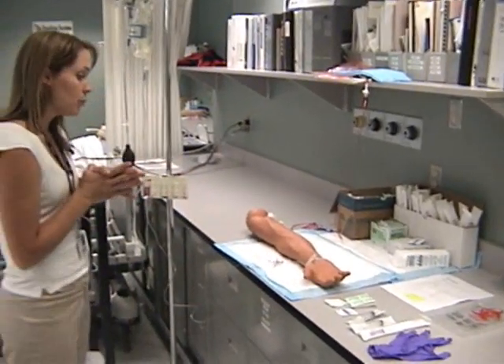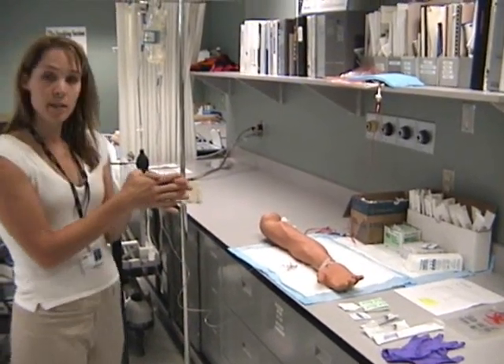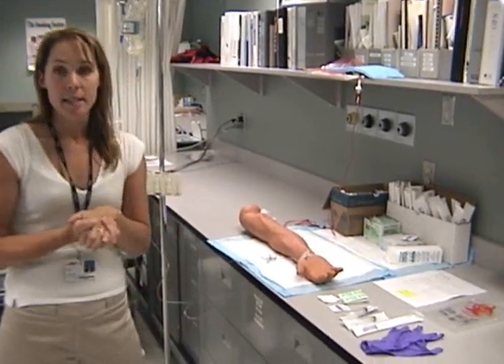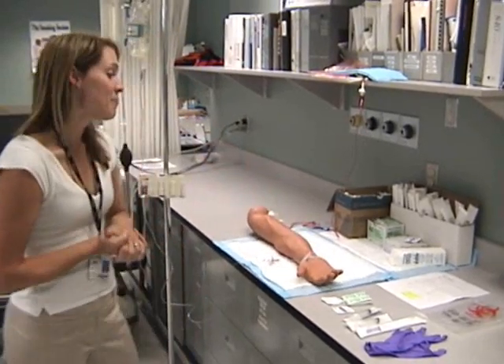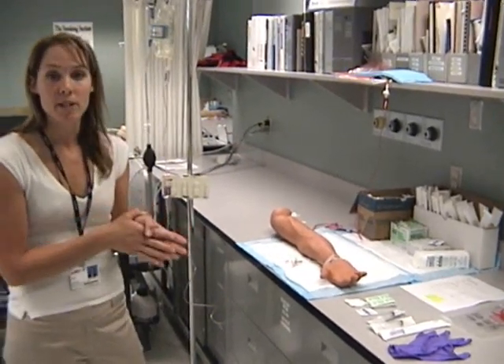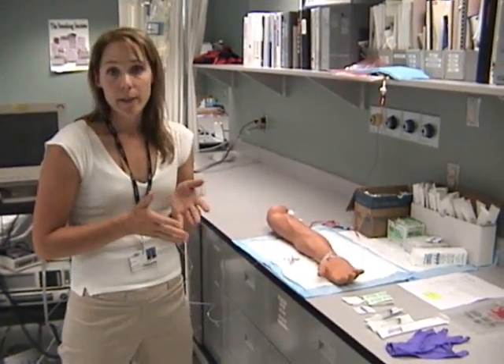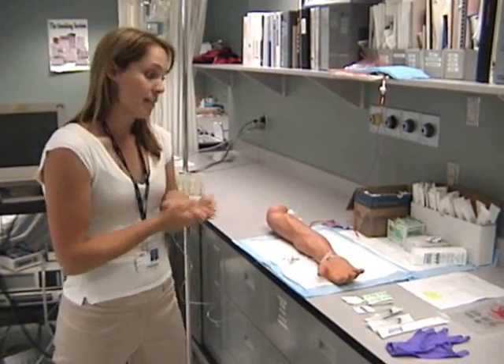When you're ready to do the procedure, introduce yourself to the patient first. So: hi, I'm Jennifer, I'm from the respiratory therapy department. Then check their ID band — this would have to be on the patient's other arm in this case. Then explain the procedure: I'm simply going to be drawing a blood sample off of the art line. You won't experience any discomfort. There are no needles involved.